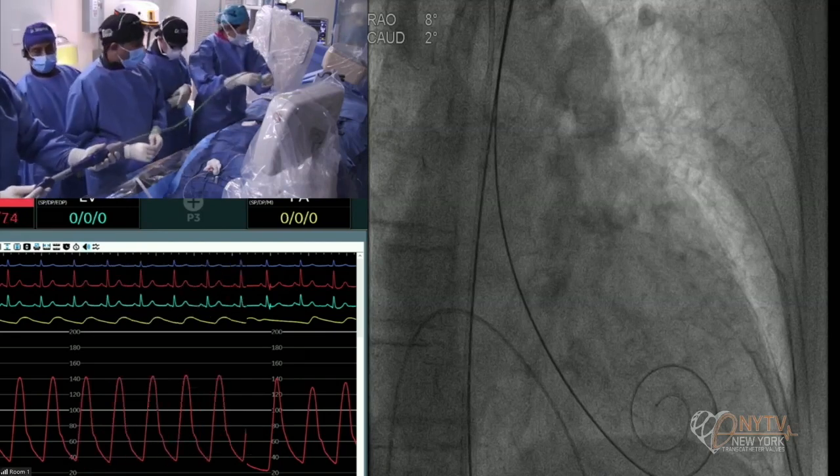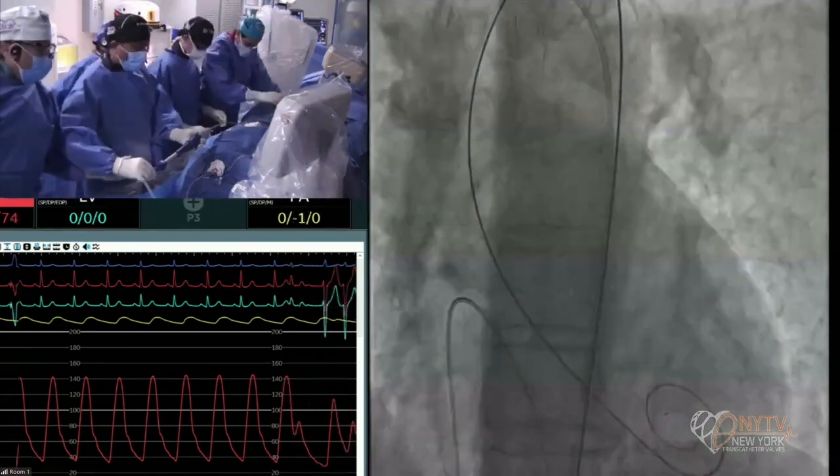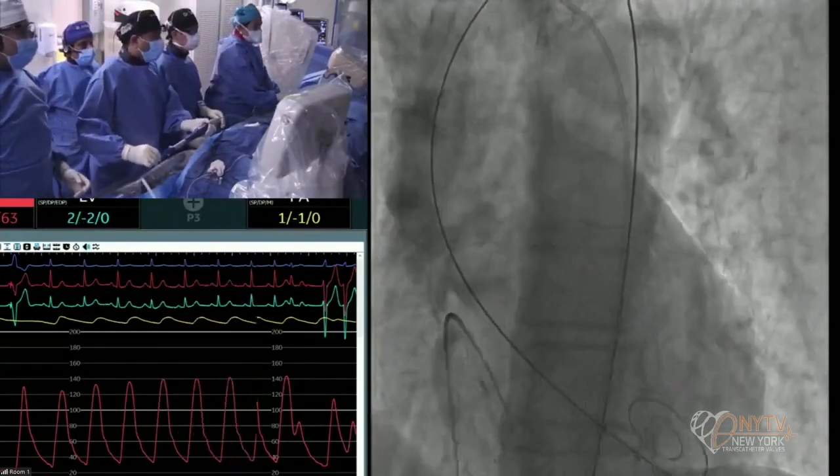So sometimes, because of the vascular impedance, even after you replace the valve, the diastolic pressure may remain low because some of this may be just calcification of the vasculature.